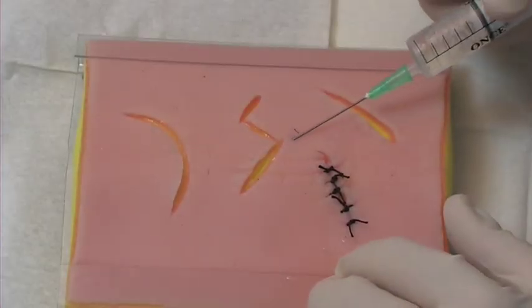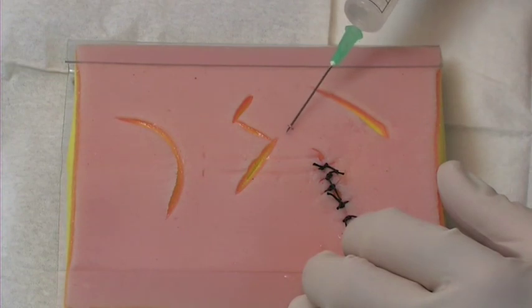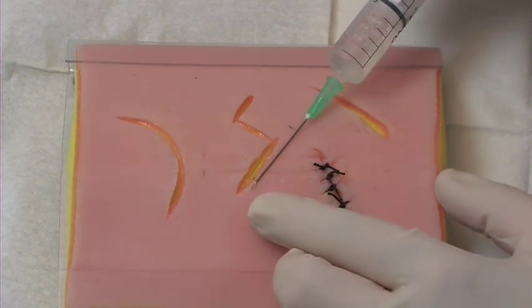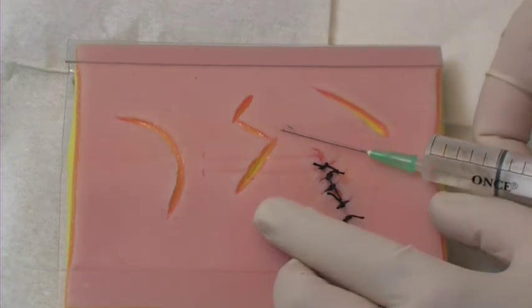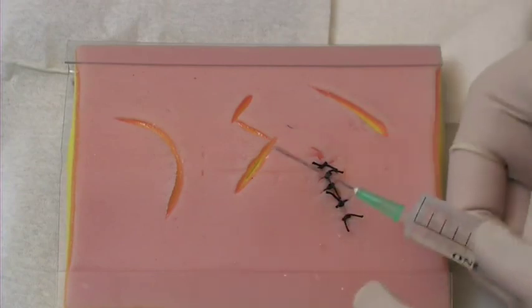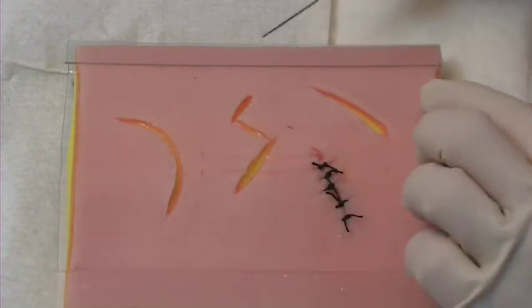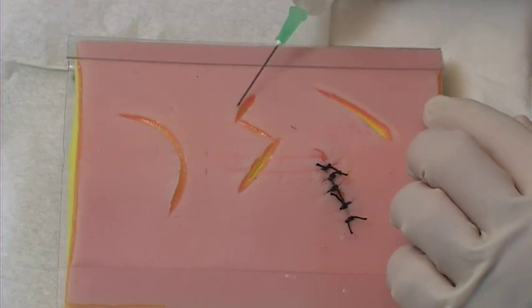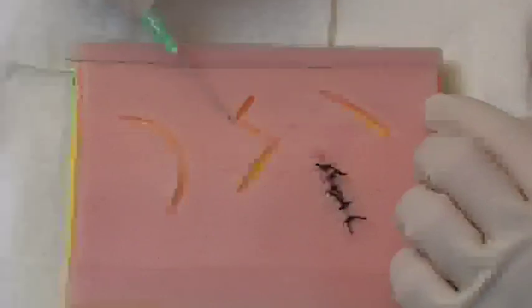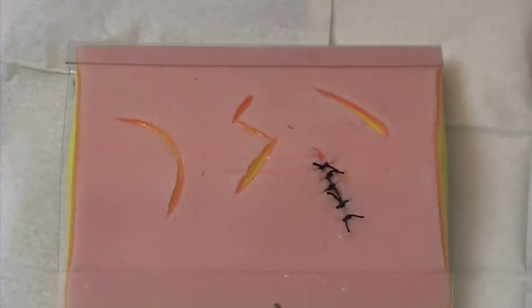To finish I might want to put one here at the end. I will infiltrate at one point, aspirate and infiltrate lignocaine. Then I will show it above, but you should be underneath it, just underneath the skin. I go along the whole length of the incision and aspirate then. As I retrieve I will be putting in lignocaine. From here I will go up the way till I go to this part here. When I take it back I infiltrate. And then I will always use a part that has got lignocaine in it, just along the way. I put my needle through, I aspirate, and then I infiltrate. I go in, go through, aspirate, and as I retrieve I put in lignocaine. Again and again. That way the whole incision should be pain free.